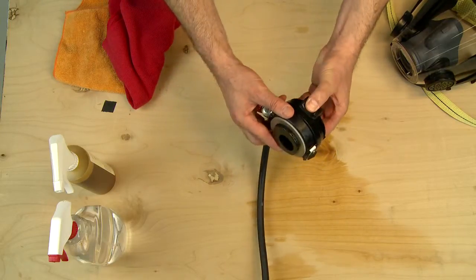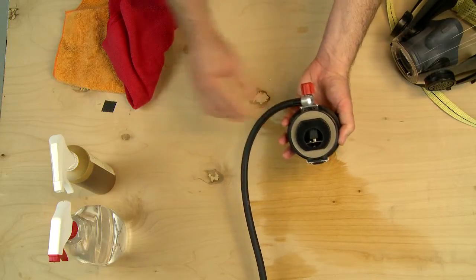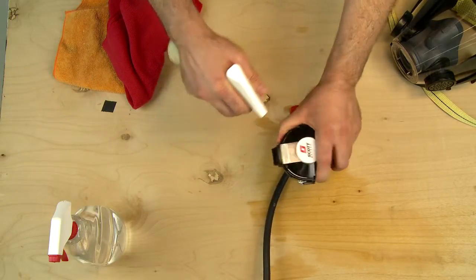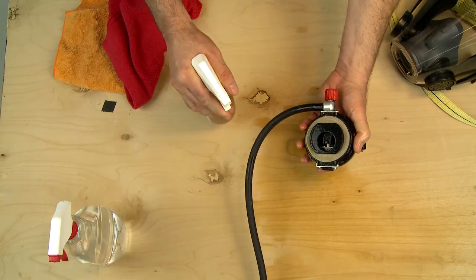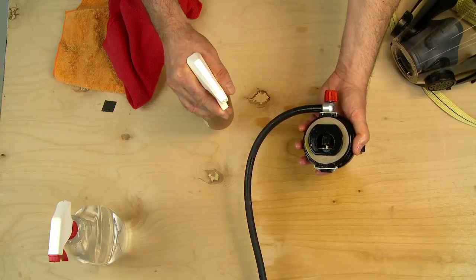Depress the donning air saver switch and close the purge knob by turning fully clockwise. Use the Scott recommended sanitizing or disinfecting cleaner in the regulator opening and the immediate area around the opening. Be sure to cover the internal components completely. Refer to your user instructions for respirator specific recommended cleaners and contact times for sanitizing and disinfecting.